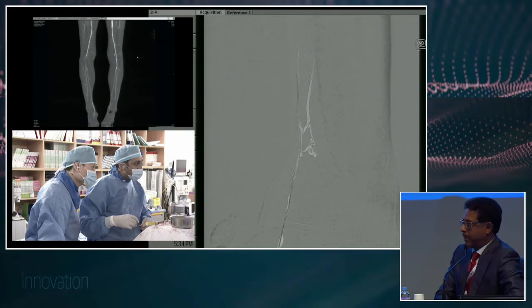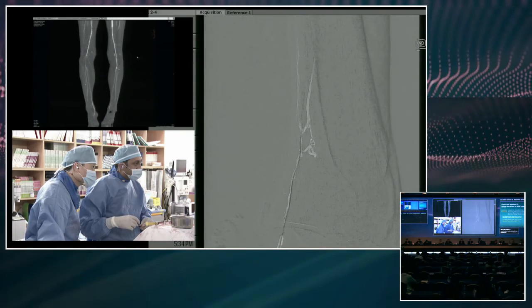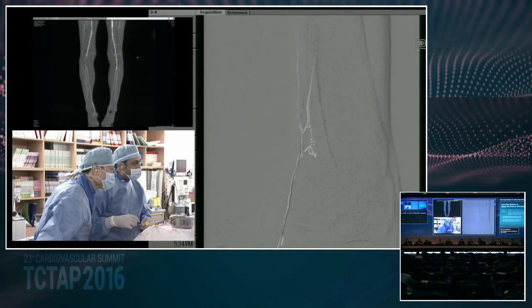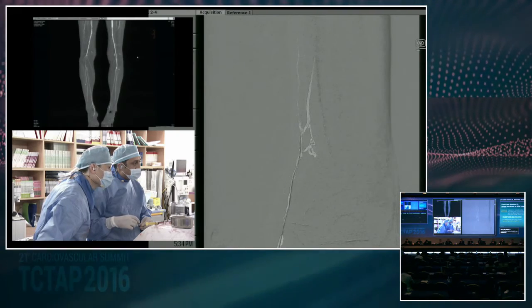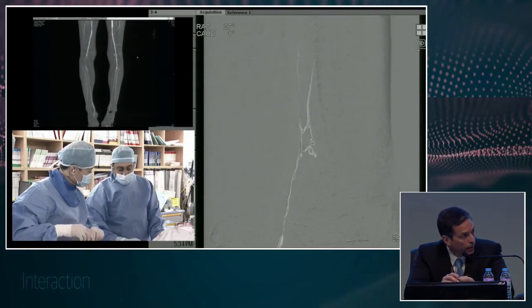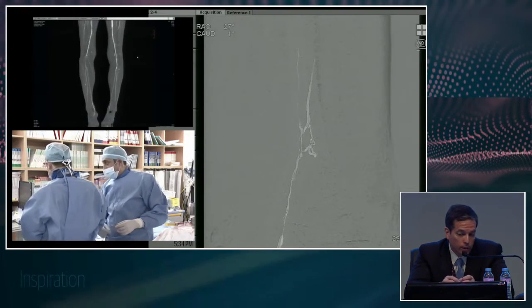Yeah, so our wire escalation is, I'm pretty simple-minded. I like a lubricious wire for most of these things, so we start with a V14 type of wire, something with a lubricious tip. And then should that fail, we can try some of the CTO wires, things like a Victory wire up to a 30-gram tip. Or if you really want to escalate, if it's just that little bit of extra push that you need, either a coil tip Victory or the V18 with some support will get you across most of these distal caps.